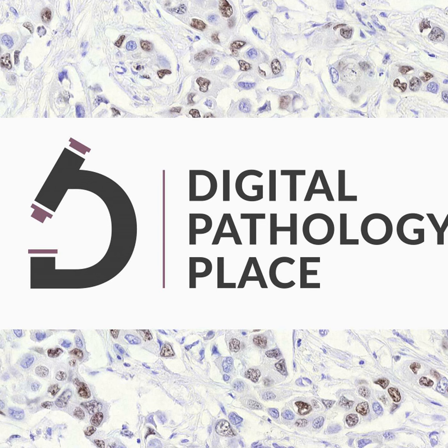So DICOM has had several different mechanisms for doing annotations on images and on subparts of images for a long time. As you can imagine, for example, in the radiotherapy world, which is heavily standardized using DICOM, they have means of drawing contours around tumors that need to be irradiated during therapy or tissue that needs to be protected. We've needed to be able to identify lesions on CT and MR scans and communicate that and display them on the screen. And so we've had annotation formats for that.